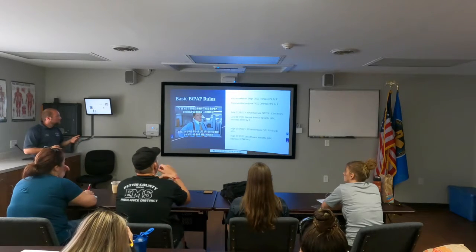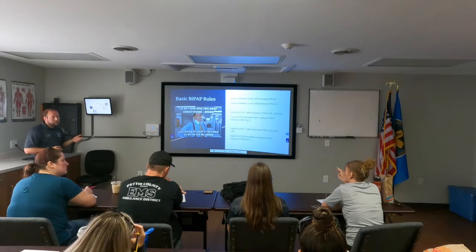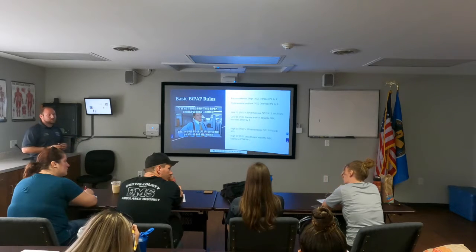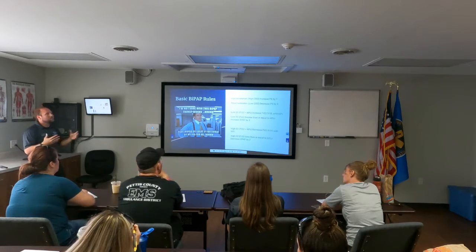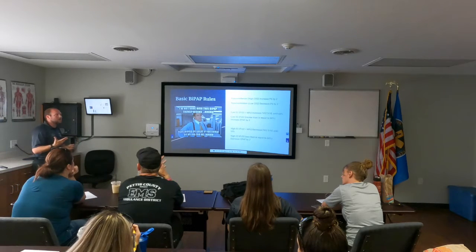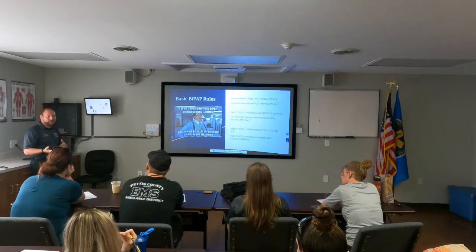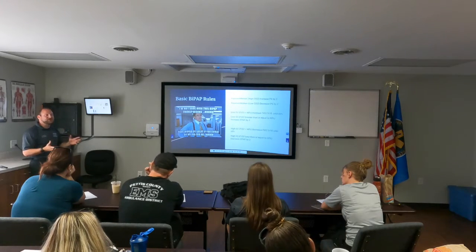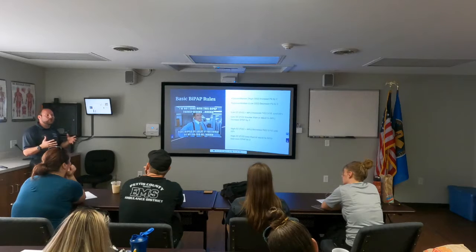So what's the initial difference in the numbers? Like when you turn it on, start on BiPAP, what's the initial gap between IPAP and EPAP? So when we set up BiPAP in the field, our initial IPAP or pressure support is going to be 10 or 15. Your EPAP is always going to be 5. So that pressure support difference is going to be 5 or 10. And that's the ideal gap right there. That's kind of where you want to be.